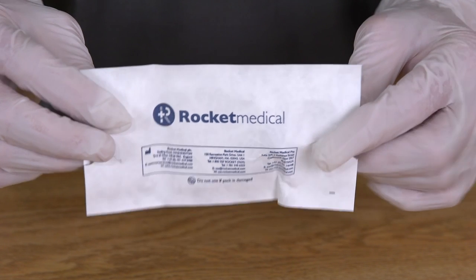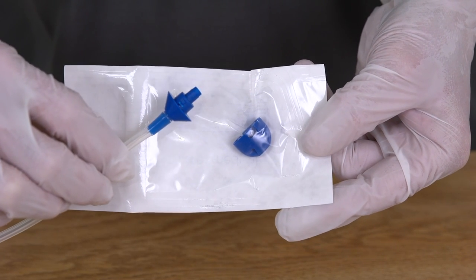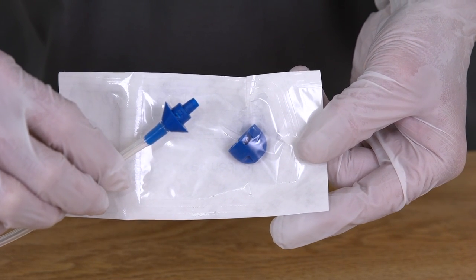One of the sealed packets contains a single large ROCKET catheter cap. This cap will be used if the patient's indwelling catheter looks like this.